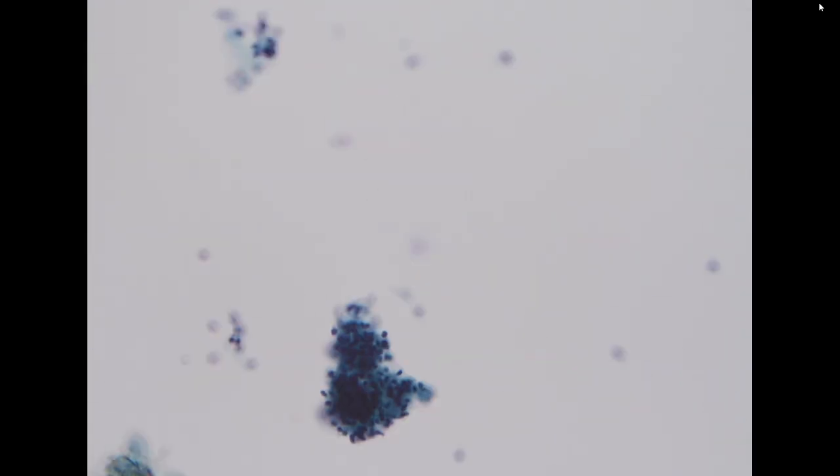So we need to exclude the possibility of a CAXPA. Here we didn't see any atypical cell, so it looks pretty good for benign pleomorphic adenoma. For benign pleomorphic adenoma, we would usually like to see the direct smear for loose stroma or for diff-quick stroma.